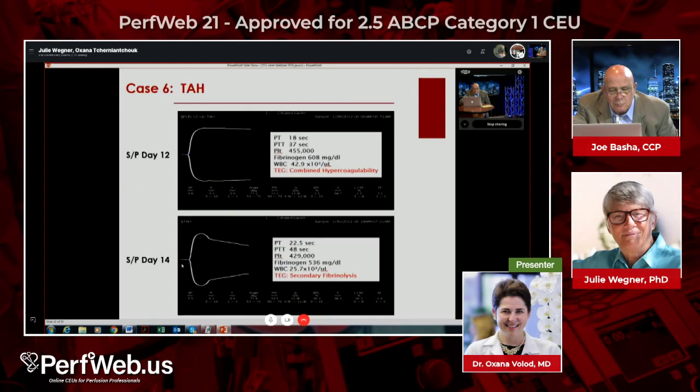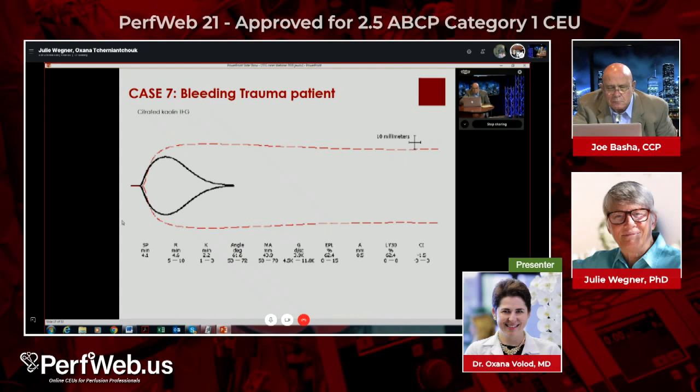So the difference is, in this particular case, the treatment would be potentially to consider giving heparin to slow down thrombin generation and continue with anticoagulation before it would potentially go into the second stage of DIC, and give antibiotics to treat an infection. Versus this case, the issue is the clot is not stable, and an antifibrinolytic agent, not factor or platelet replacement, would be the treatment of choice.